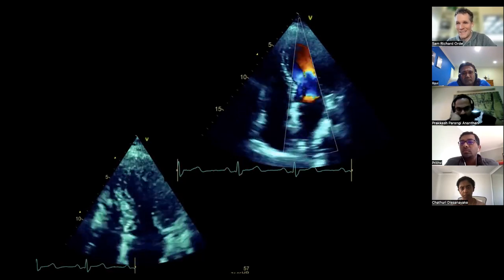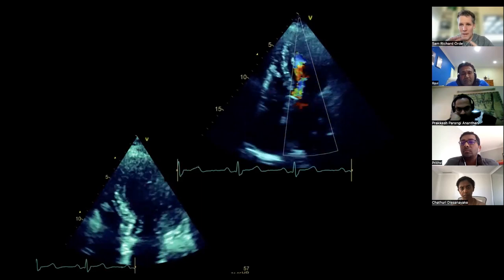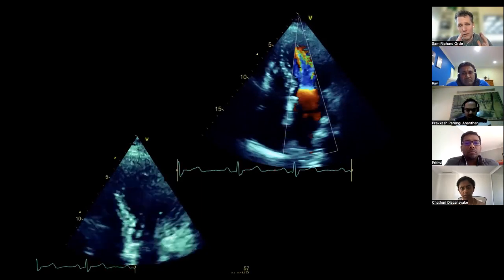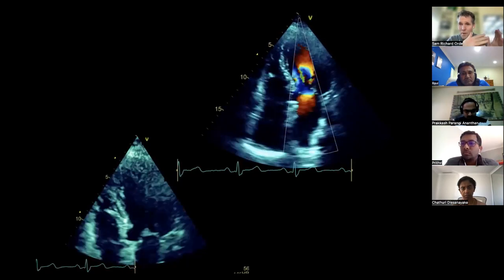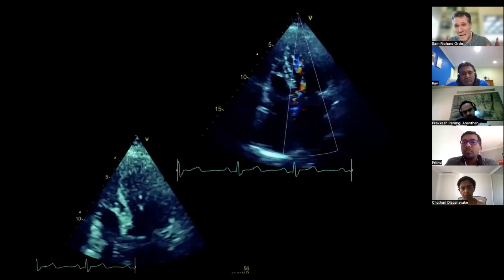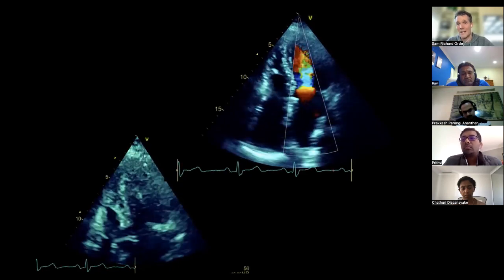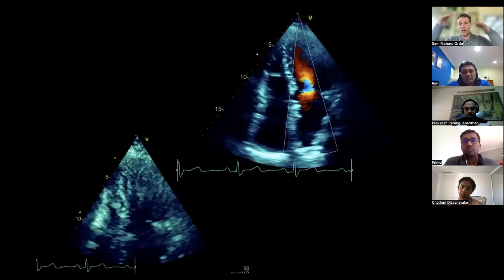And that's what this afternoon's a little bit about, just to try and give you a bit of a nudge. You've got to try and be able to put things together. If I show you a 2D picture and there's something in there which you pick up, that's potentially going to be of relevance later on in the case. If we're only allowed to give you 5 slides as the maximum for a case, we try and make sure that there's a thread that goes through and builds as it goes through.